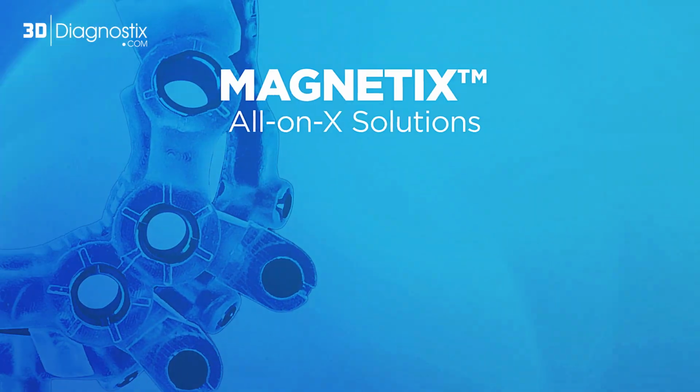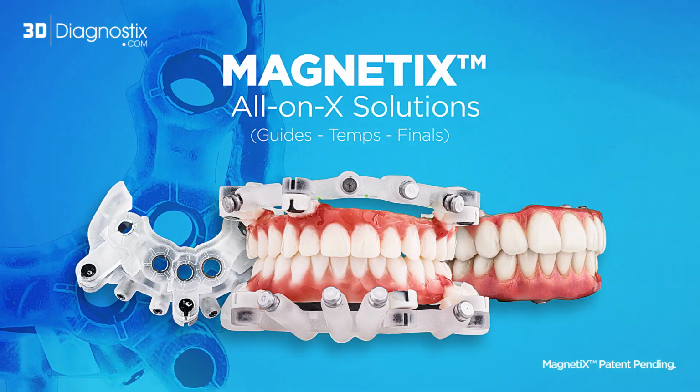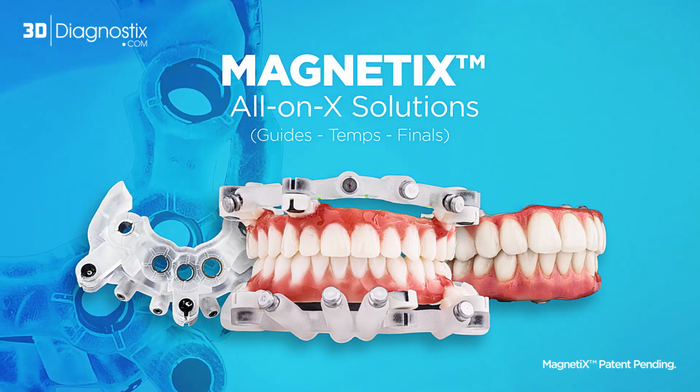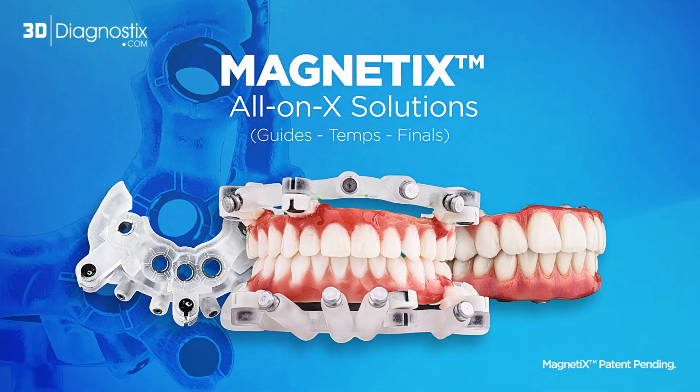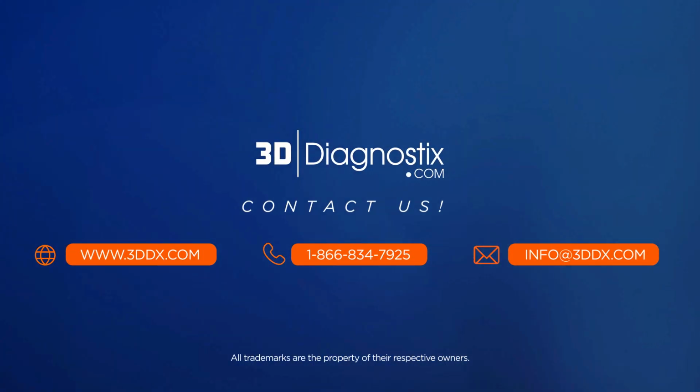This workflow ensures efficient, accurate, and immediate temporization by seamlessly combining 3DDX Magnetix solutions, expertly designed restorations, and the precision of the OPTISPLINT system. Another workflow will be available soon for final restoration records.